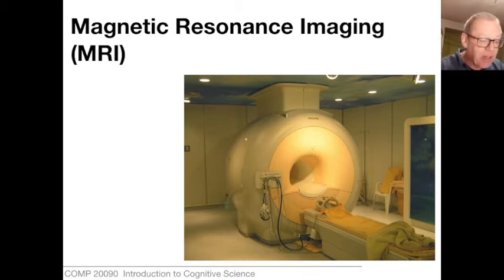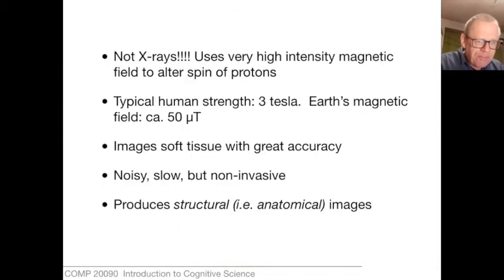Perhaps you've been inside a scanner. Many people have. They're absolutely routine in many clinical applications. They're a great way of obtaining detailed images about any part of the body. And indeed, they're not restricted to bodies. Scanners are used for investigating mummies, archaeological artifacts. They have the great ability to see through things, but they are not X-rays.